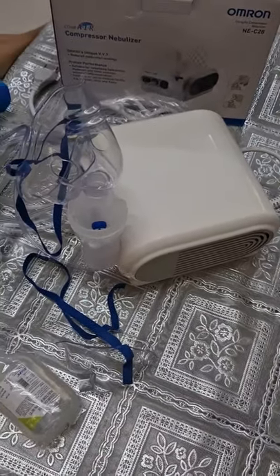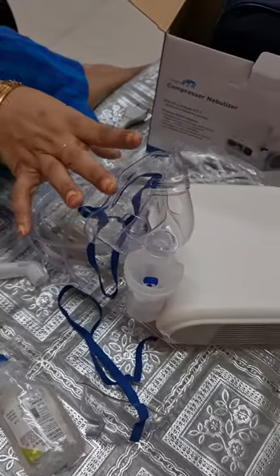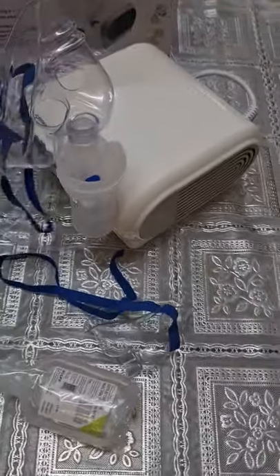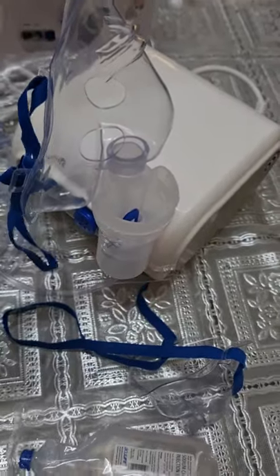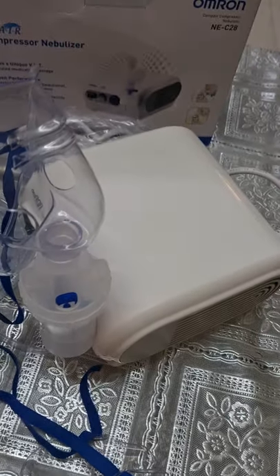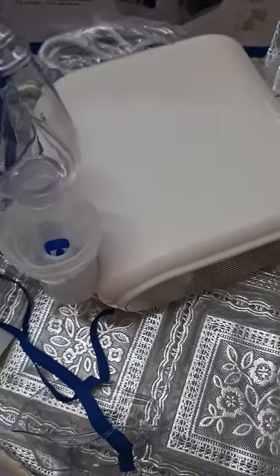Now comes the cleaning part. You need to clean your mask and certain other parts. There are certain parts which you need not clean — that is your compressor and air tube. Make sure not to clean these. Once the treatment is over, remove the pipe from the compressor and just wash the mouthpiece, your mask, and the medication tank. You can wash them with hot tap water and then spread them in a clean dry area to make them dry. Then you can pack and store them safely.